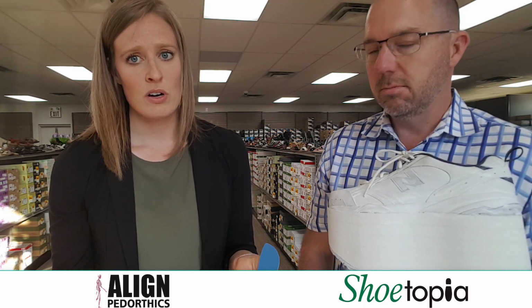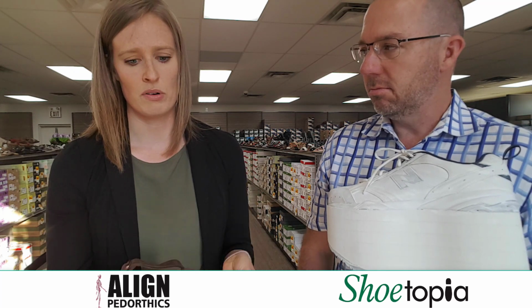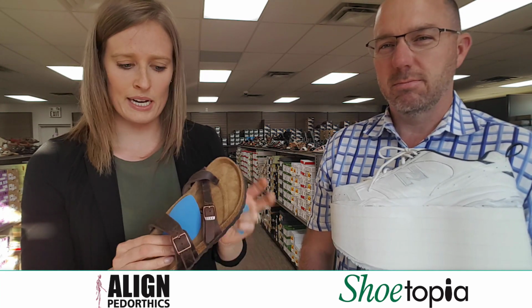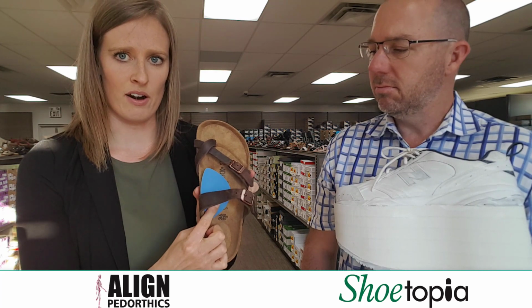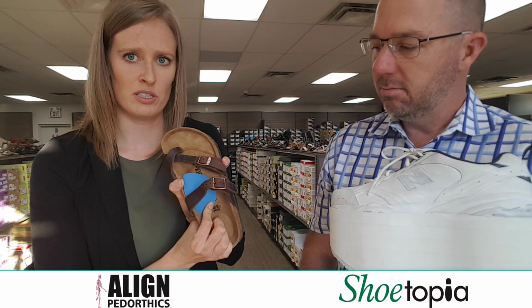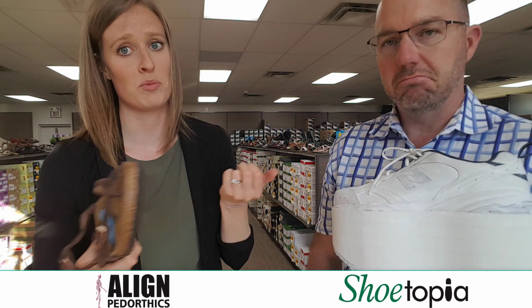Maybe you're used to wearing an orthotic and then you go to something like this, it just isn't enough to feel comfortable. So one of the big things that I do is I'll sometimes add in what we call an arch cookie or a scaphoid pad, and it actually sits on top of the support that's already there. This is blue, but I will cover it up with a brown suede to match, and that just gives you a little extra piece of support. That's about $30 for a pair of sandals, so it's not like you're breaking the bank.